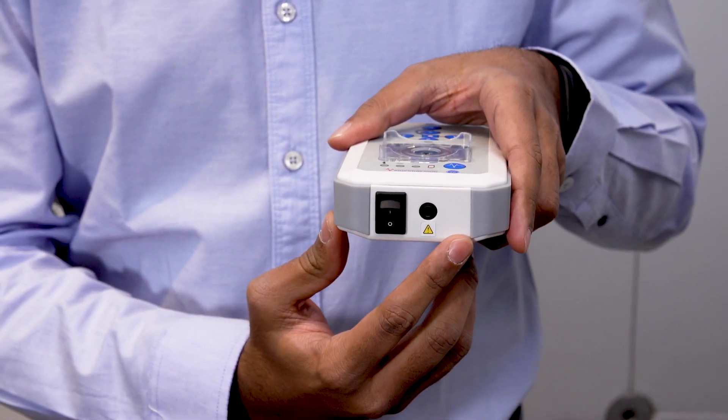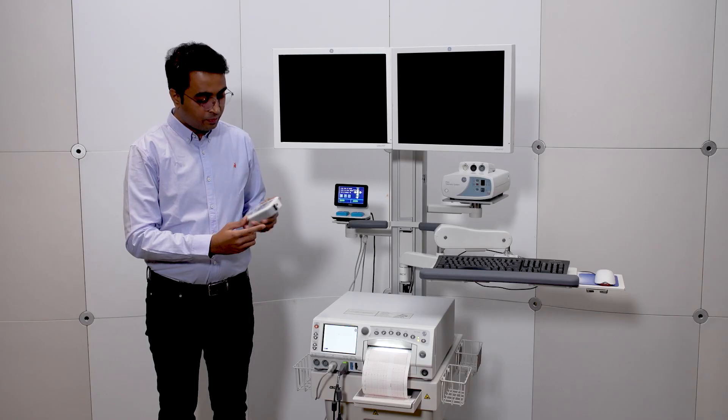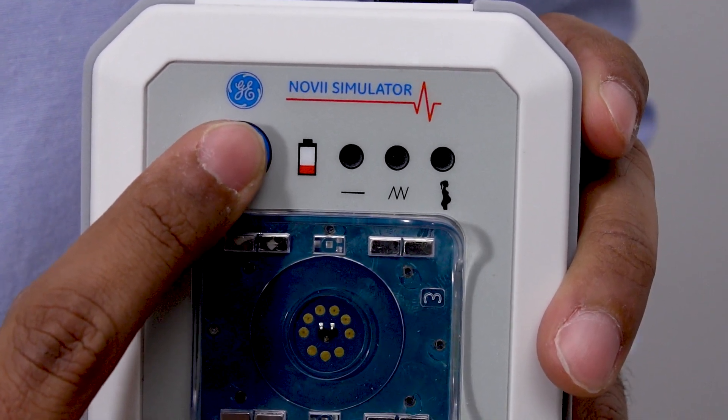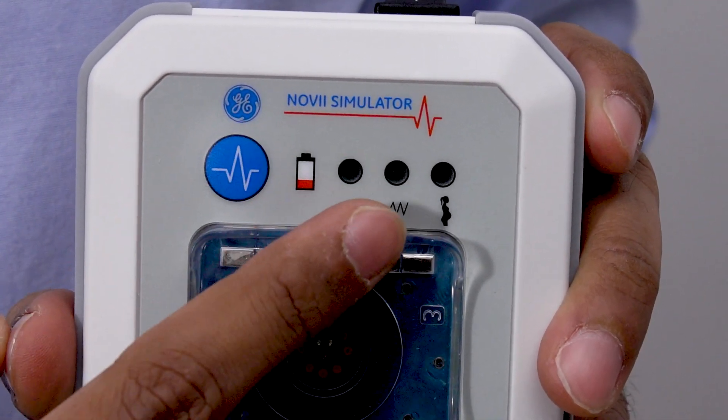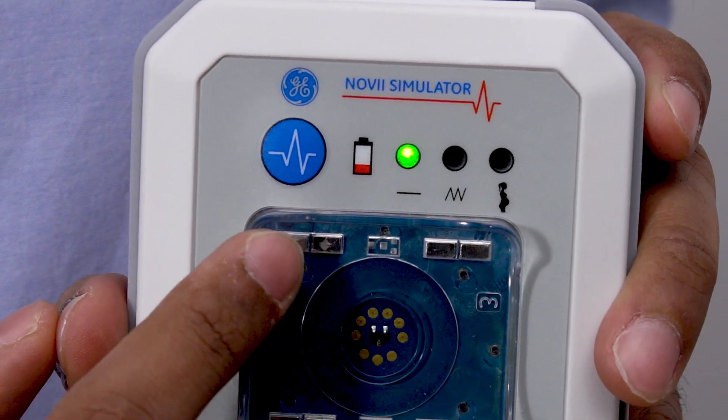Also, it contains an audio jack, which is for authorized personnel only. The front of the simulator has a blue mode selection button. Pressing this button will select a mode setting. You can choose between Constant, Pattern, and Demo mode. Each mode is indicated with a light. Let's see that again.